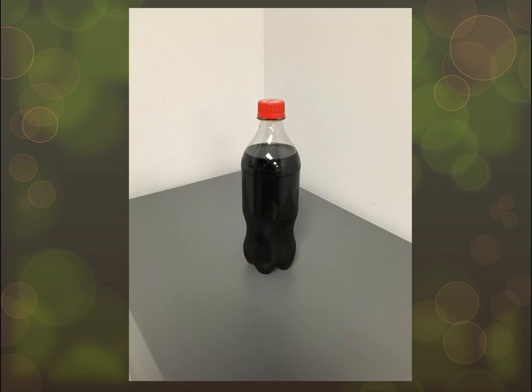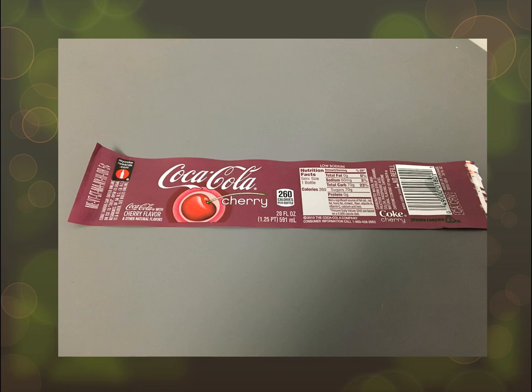And that's not just for humans. Again, that would be for computers. When these DICOM files move around, the computers use the DICOM header to figure out what that image pixel data is. Without the DICOM header, the image is useless. I can't process it or use it in any way. And there's my DICOM header, so I can tell you that that is actually a Cherry Coke. And I'm going to have some image pixel data right now. Image pixel data tastes good.